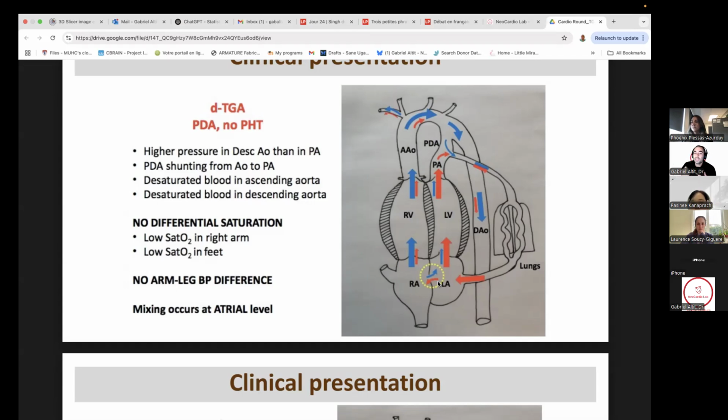And that's why when you assess preload, we often look, yes, at the IVC and SVC when they're relatively not on high mean airway pressure on the ventilator, but it's not sufficient, because your left atrial preload is really dependent on what's happening at the level of the lungs. Okay, and we can talk a bit more about that on other cases.